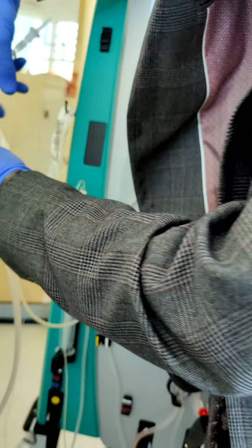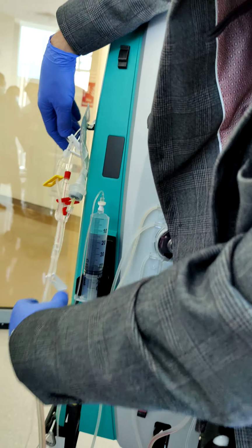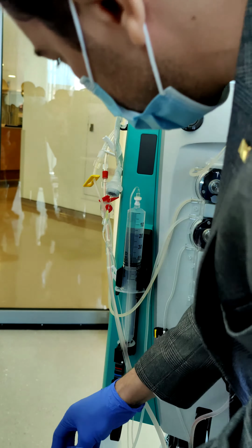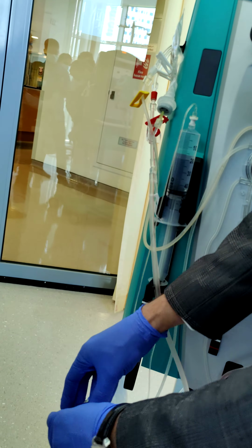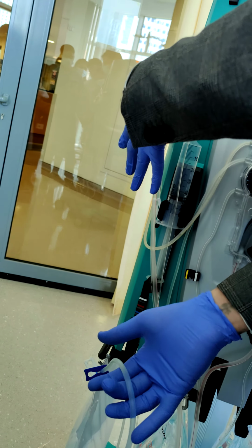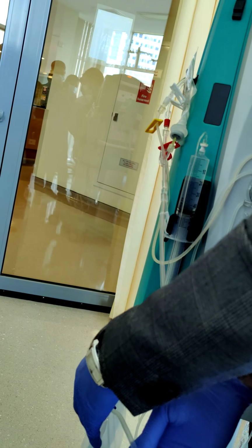Many times this has happened, in different hospitals, even here. We enjoy too much clamping. Remember, there are 6 clamps: 4 on the Y connector and 2 on the effluent bag, except the white one.